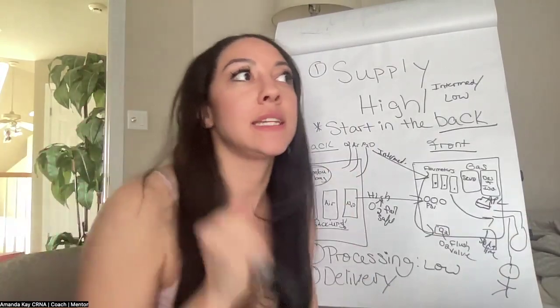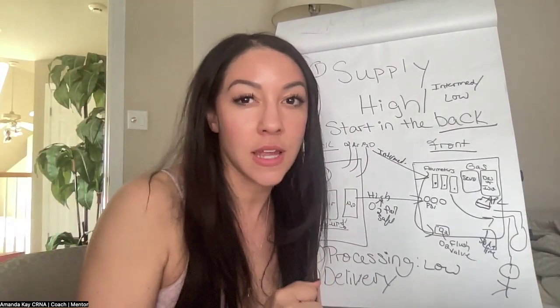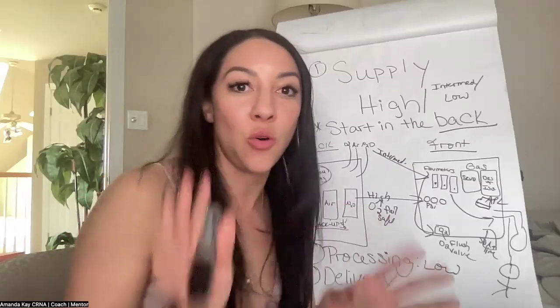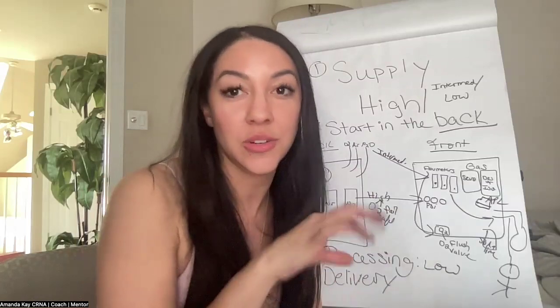These are categorized. I did another video on these circuits: open, semi-open, semi-closed, and closed. I have a whole video on that, so I will link that as well so you guys can watch it.